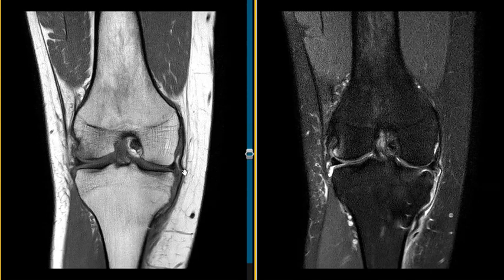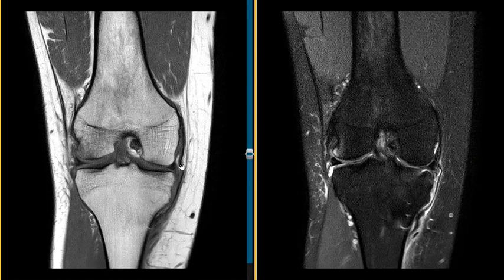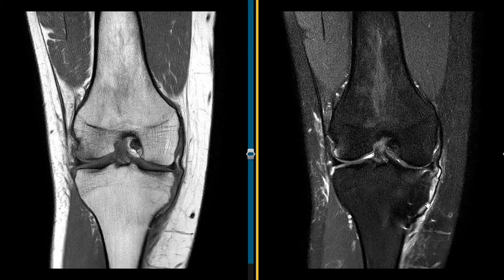Now, normally when the MCL tears, it's torn up high near the femoral attachment, and usually it's really thickened and edematous and irregular. In my experience, when the MCL tears distally, it seems to peel off like this, and we see an intact MCL, and we just see the periosteal injury and the uplifting from the tibia.